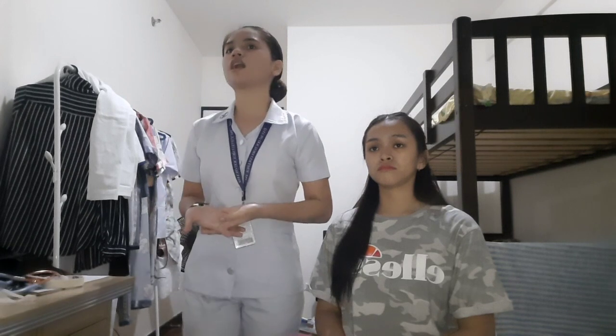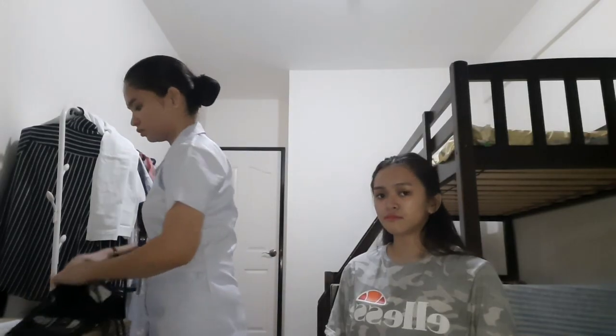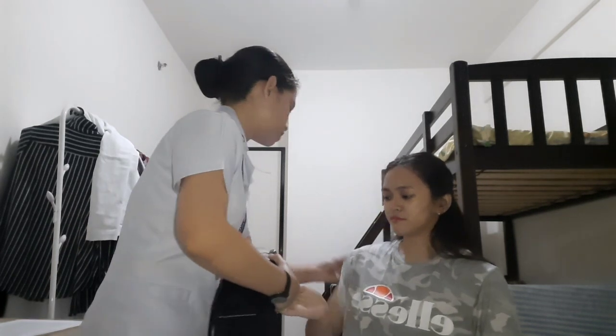Then I will place the cuff. The inflatable bag is centered and lies midway over the anterior surface of the brachial artery. The brachial artery should be at the center of the two tubings of the cuff. Pressure applied directly to the artery will yield the most accurate readings. Okay, ma'am, your arm.